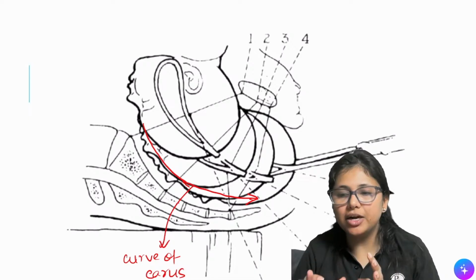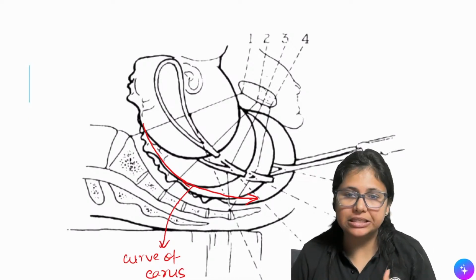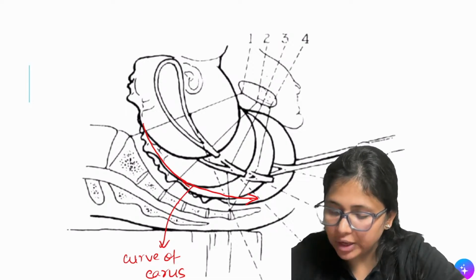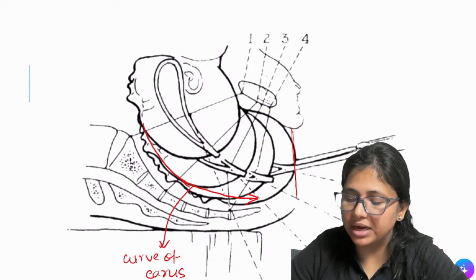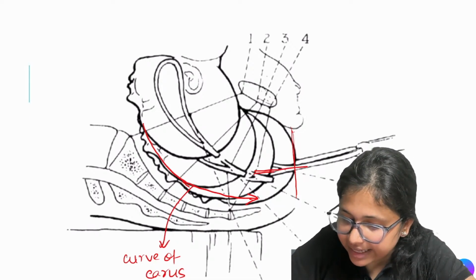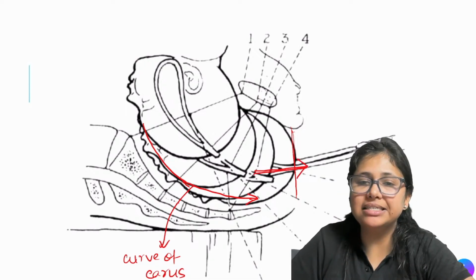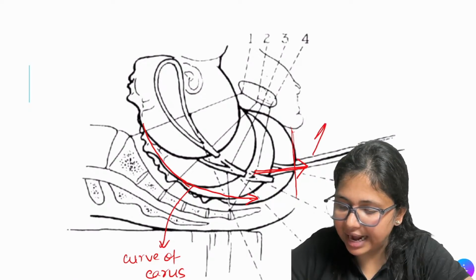So basically what we are doing is we are going to follow the natural path of the birth canal in our pull, right? So if the baby is just at the outlet, which means what? We are using the outlet forceps. So my direction of pull is going to be this side, right? But remember, the baby delivers its head by extension. So it is going to be straight and upward.